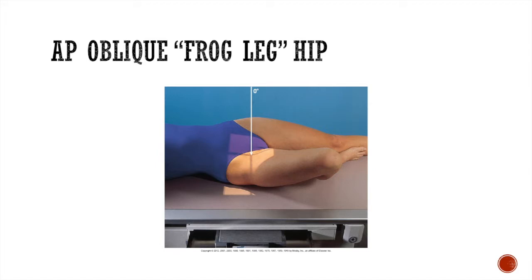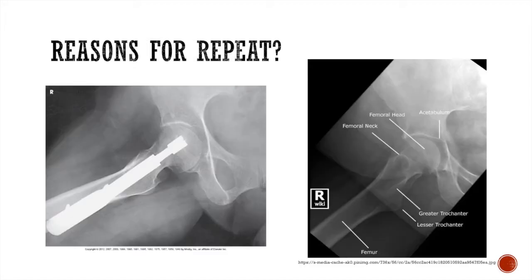You want to also locate the femoral neck and move the patient until the central ray is entering through the femoral neck. You want to collimate to the IR, whether that would be 10 by 12 inches lengthwise, and cock the tube to get it in the right position. Or if you're using a 14 by 17 inch IR, you want to collimate side to side. You want to shield the abdomen and chest and other part of the femur. You want to use AEC's center cell selection with approximately 70 to 75 kVp, and you want to take the exposure on suspended respiration.